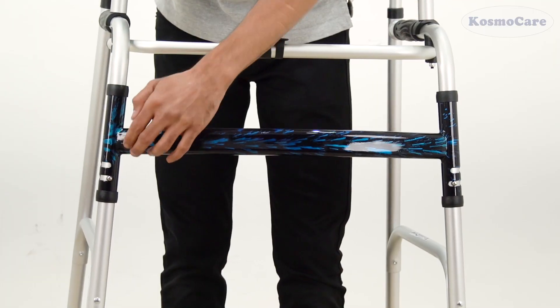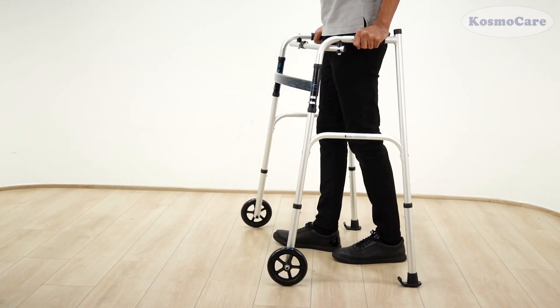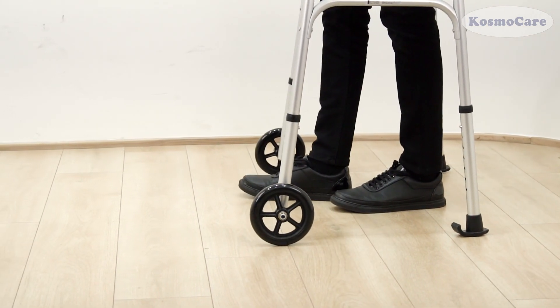The Walker can be used either as a standard Walker or can be converted to a reciprocal Walker. This enables the user to walk without having to lift the Walker frame.